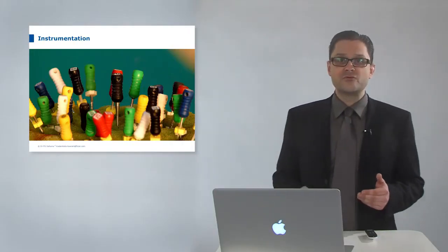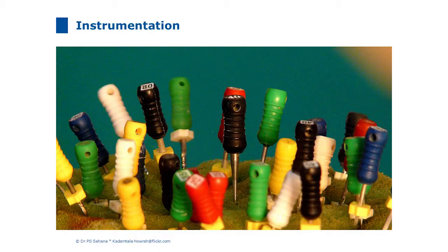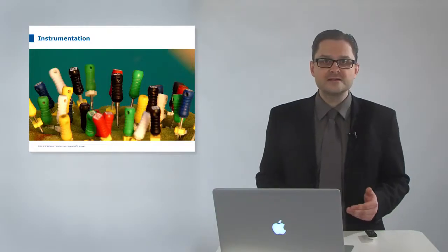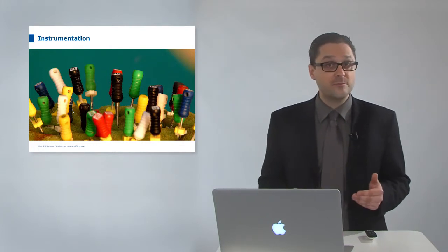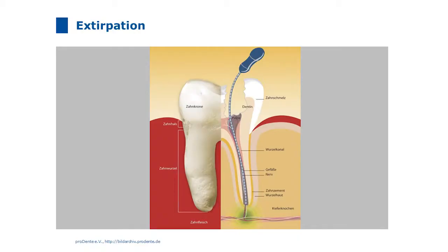Then the root canal preparation is performed with these little endodontic hand files in the tooth swimming pool filled with sodium hypochlorite. The wetness makes it easier to work. You have a better lubrication for the files. With the preparation in the root canal, you can automatically do a disinfection. Step by step, you have to reach now the whole root canal to the apex, cleaning and disinfecting the inner tooth. Here you can see the removal of the soft tissue in the root canal, which is called extirpation.